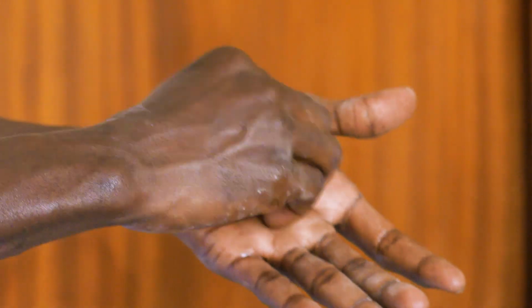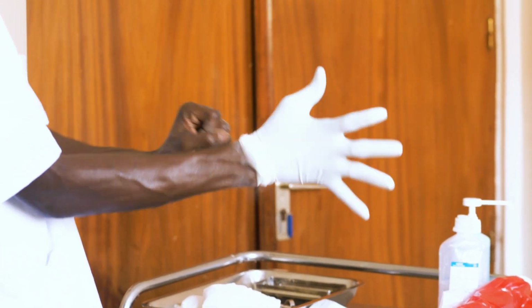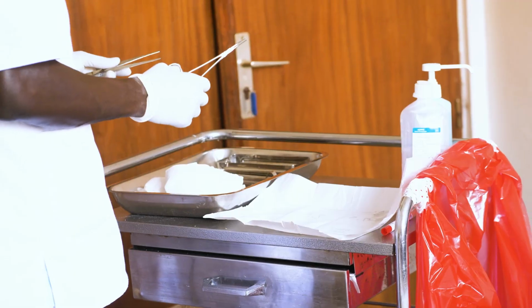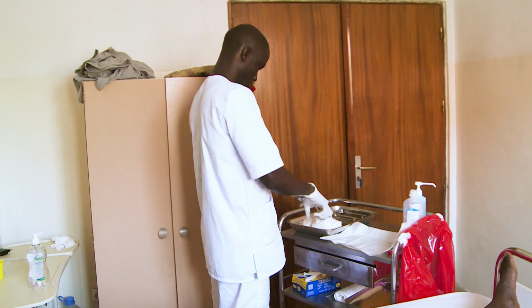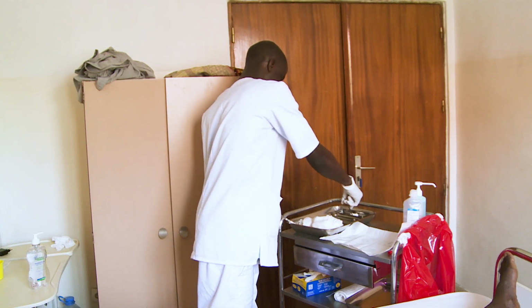Perform hand hygiene before a clean aseptic task and don sterile gloves. In this video, sterile gloves are used as the nurse will be reaching within the sterile field. Using sterile forceps, carefully manipulate the sterile gauze before soaking it in saline.